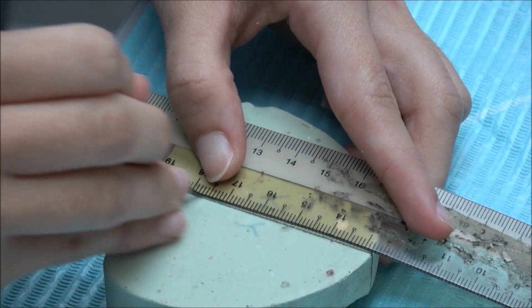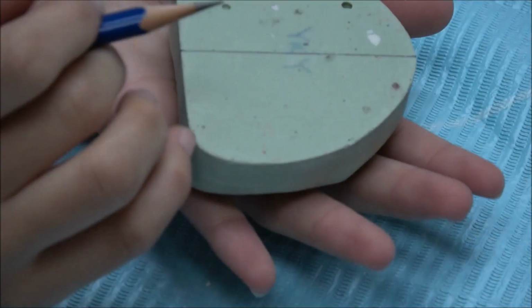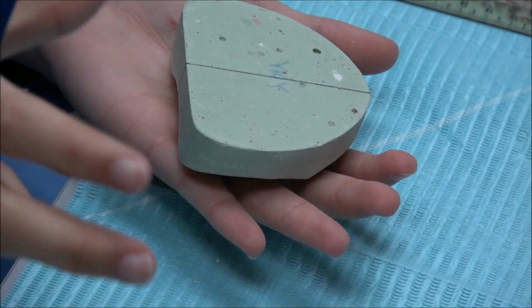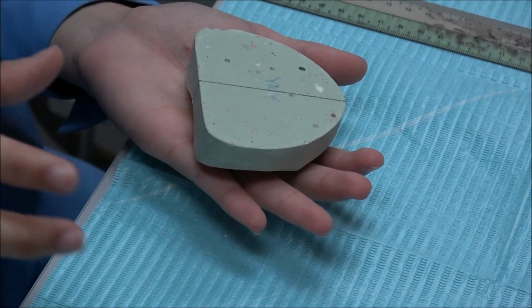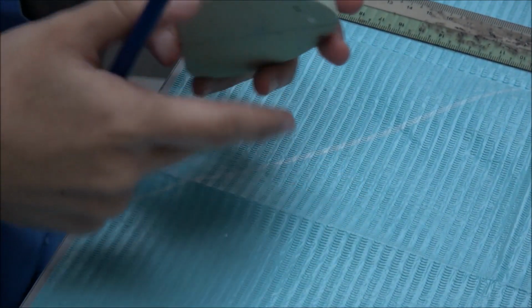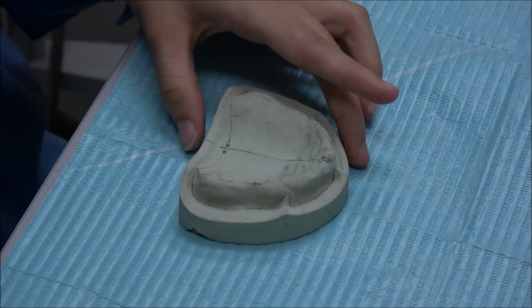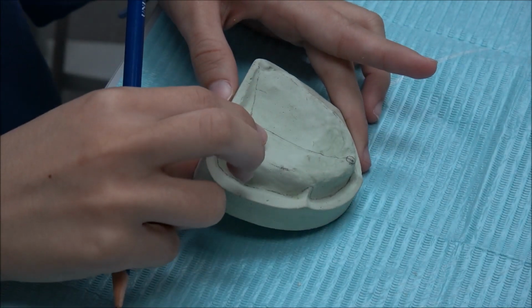So why do we mark this line? It is just to make it easier for you all to make sure, when we mount it, that it is in the middle of the articulator, so we won't go wrong. So after we draw, we can trim our index.